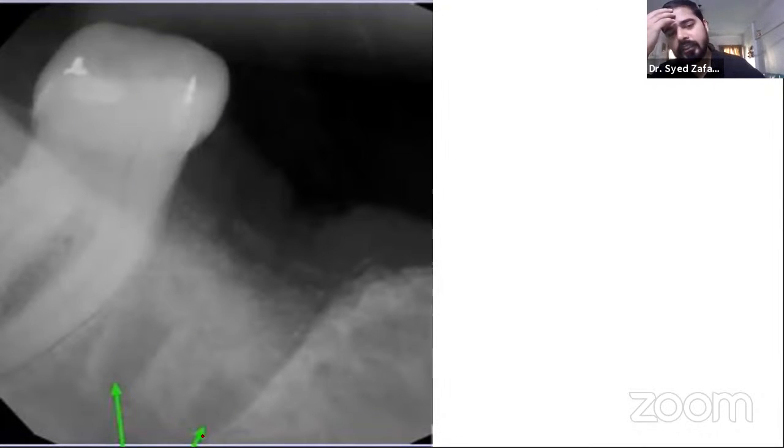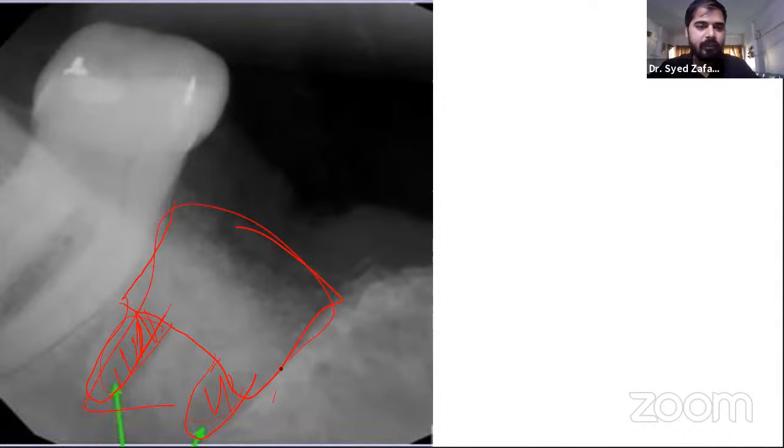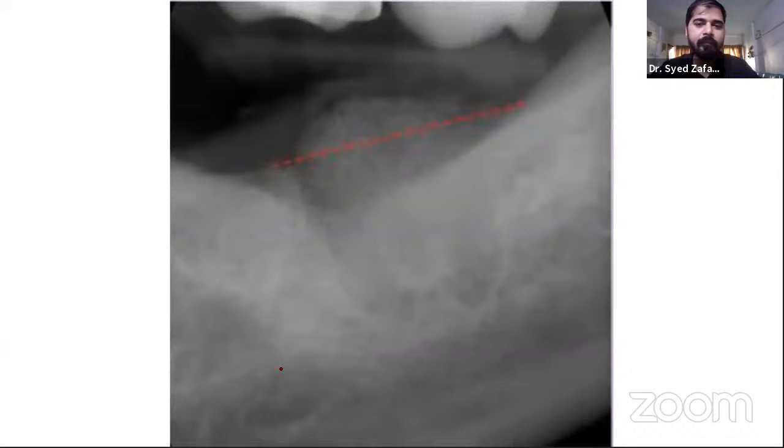Most important thing you can see in this picture, mostly when dentists are placing a bone, they forget to place it till the end of the tooth. You can see in their socket, the apex is empty. So mostly you first insert in the socket, then cover the whole thing. And after the bone grafting, you also take x-rays. You can also clearly see it.